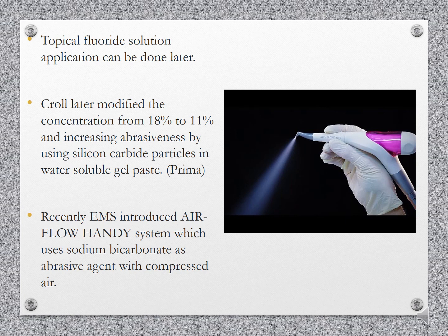Kroll later modified this concentration from 18 to 11% and increased abrasiveness by using silicon carbide particles in water-soluble gel paste. Recently, a new system called Airflow Handy, which uses sodium bicarbonate as abrasive agent with compressed air, has come into the market.